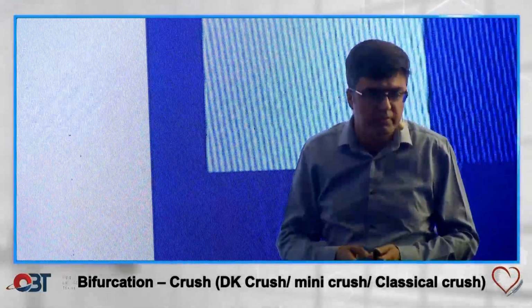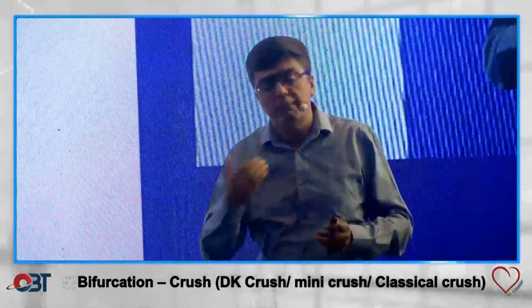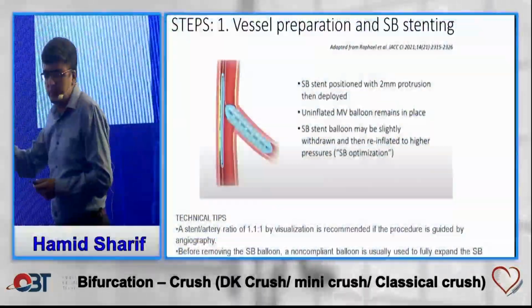So make sure that your main branch and side branch are properly assessed. Ideally with imaging, if you have that ability, you do imaging and make sure if there is any calcification, plaque modification needs to be done with a cutting balloon or with rotablation. You do it up front rather than deploying stents and doing it later on. So this is the main important step, vessel preparation.